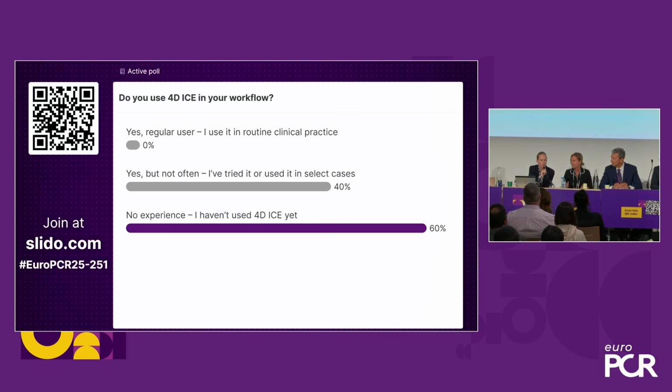I think what you need is at least one very good image. When we talk about tricuspid valve interventions, you need at least one good image. It may be transgastric. If you have a perfect transgastric view, I think you are probably able to do it with TOE, or if you have a really good transesophageal. But if both windows are really not good, then you should definitely think about it. Because otherwise we know that the imaging part is so important that it really translates into the outcome. So if we have poor imaging, the outcome might be poor for the patient as well.